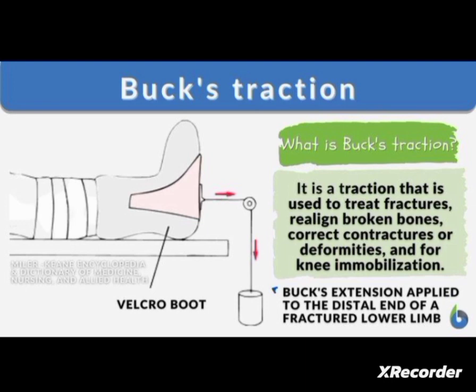The patient lies generally in a recumbent position. Traction may be removed for skin care. So that is regarding Buck's extension traction.